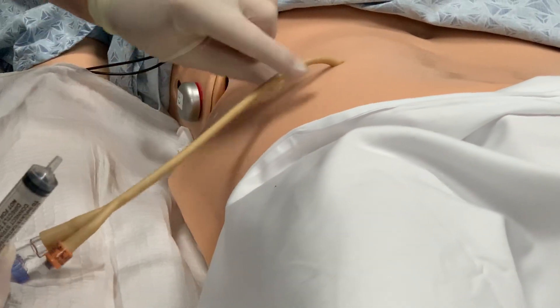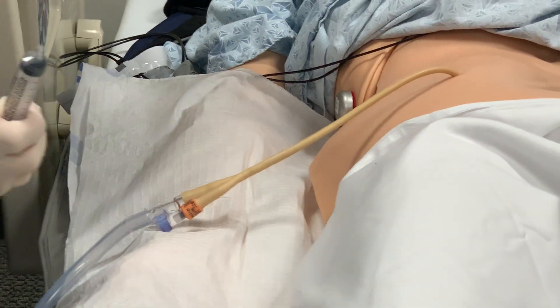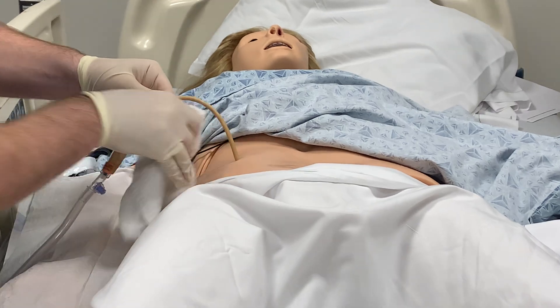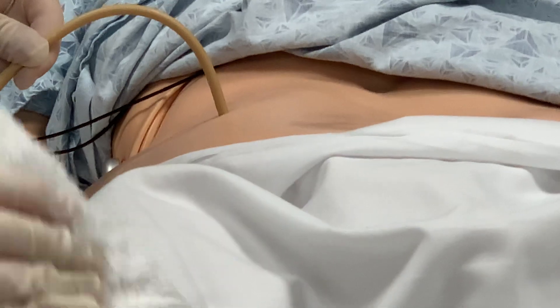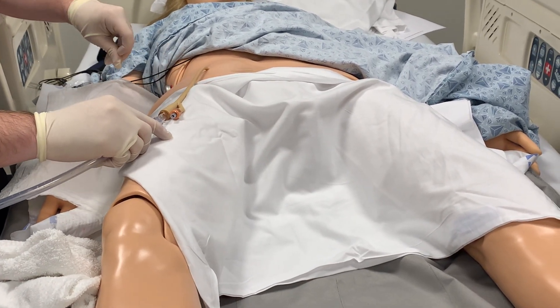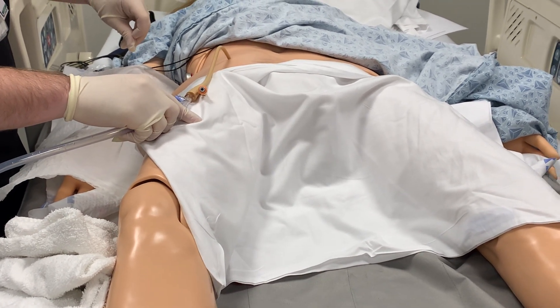We will remove our syringe. Then we will take our washcloths — starting with the soapy washcloth — and wash around the urinary opening, washing off the betadine. Then we will use a warm rinse towel, again washing around the urinary opening to remove the betadine. If we're using a leg strap or strap to secure the catheter, we would apply that at this point, making sure the catheter isn't tugging. That concludes our instructional video on inserting a suprapubic tube. Thank you.